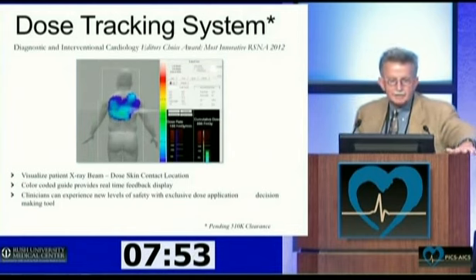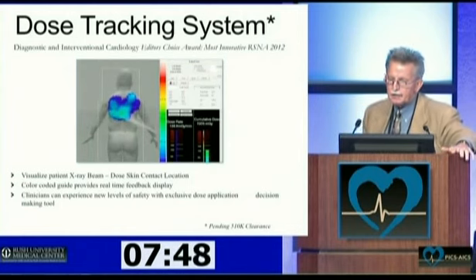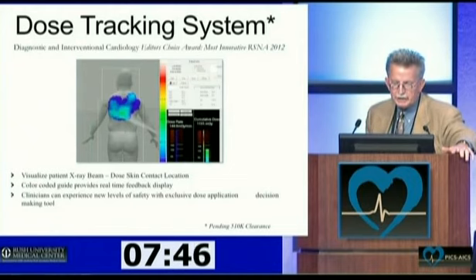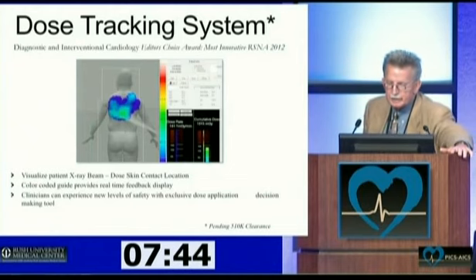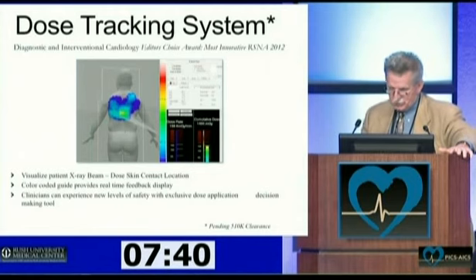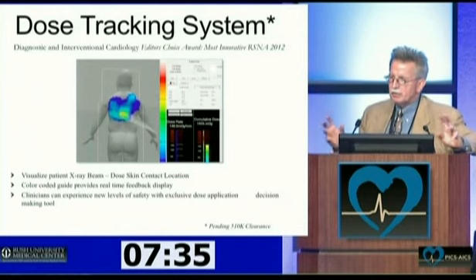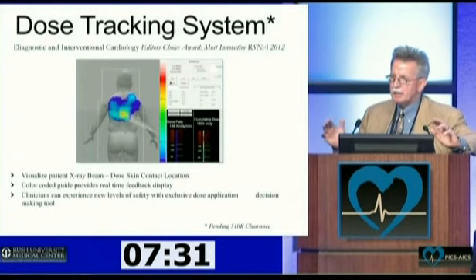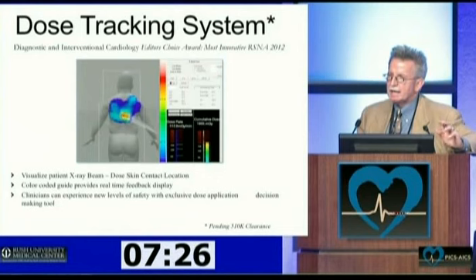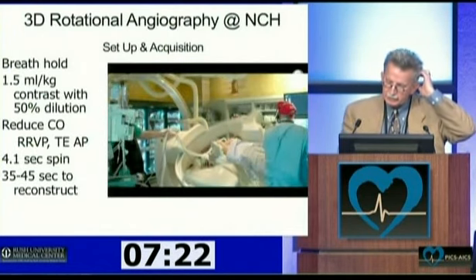It's a dose tracking system. It was recently awarded Most Innovative at RSNA in 2012 when it was introduced. And you can see it's live, up-to-date imaging of the various areas. Is this moving around? There we go. We like this, particularly for some of our large patients, because we could then start changing camera angles as we watched if a certain area of the skin is getting more radiation than we'd like, and we then move that around. So we think this is going to be a big advantage.